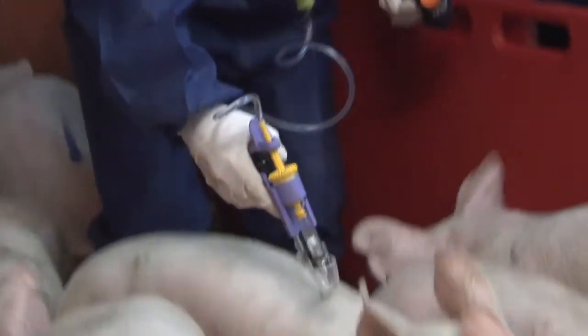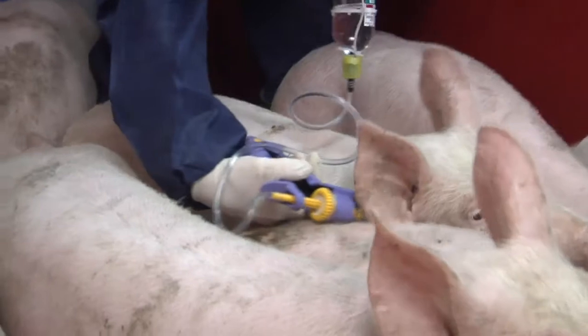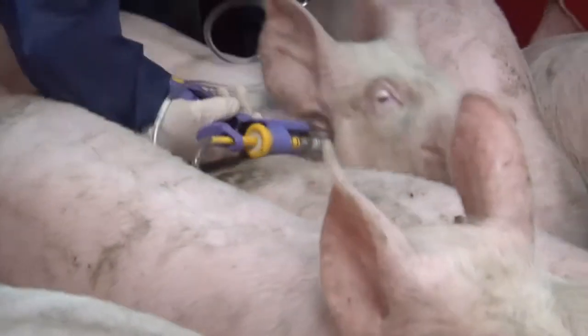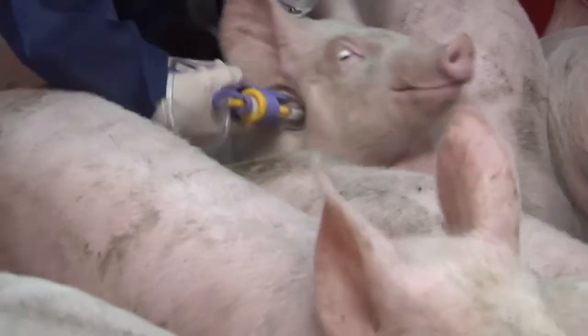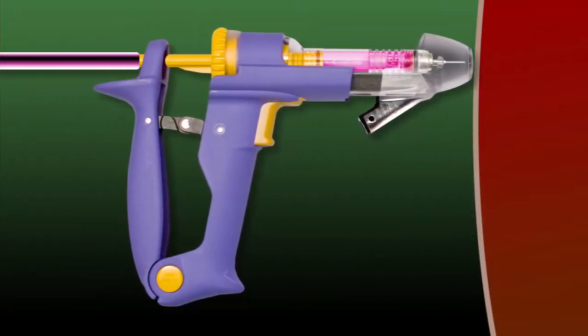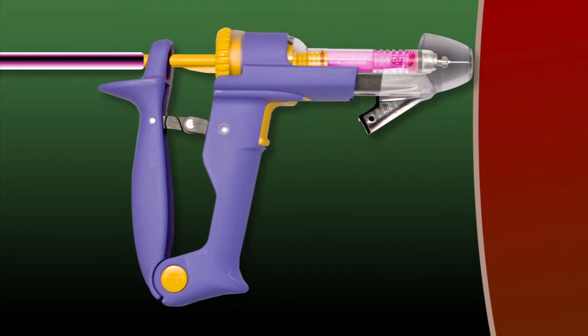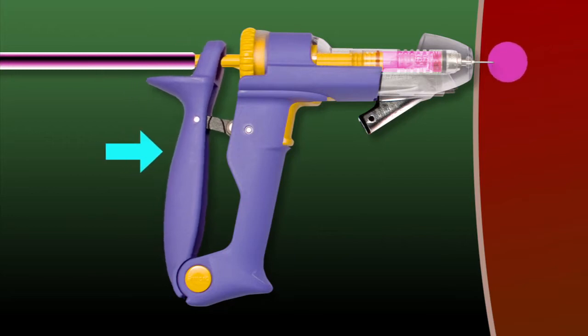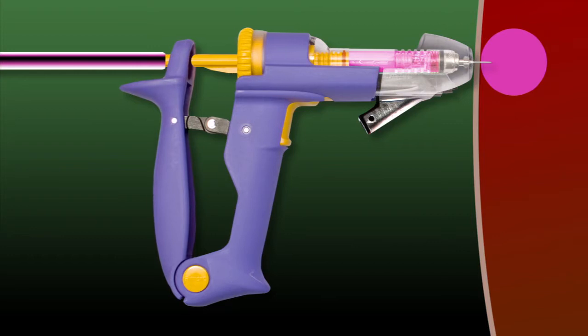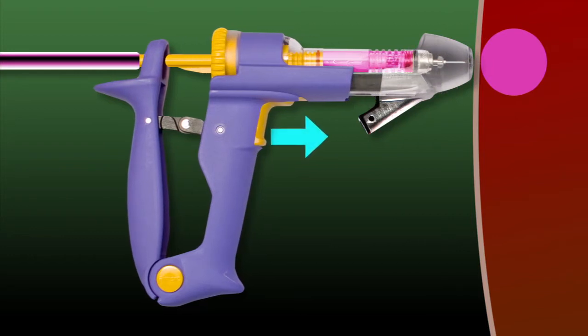If you think the injection has not been given correctly to a particular animal, then you should try again before marking it. A second dose will not harm the pig, so it is better to be sure and inject again if there is any doubt. In order to benefit fully from the safety features of the injector, it is essential that the trigger is not squeezed in between injections. If it is, the safety features will not work, and in addition, the pigs will feel the needle as soon as you try to find the right injection site.